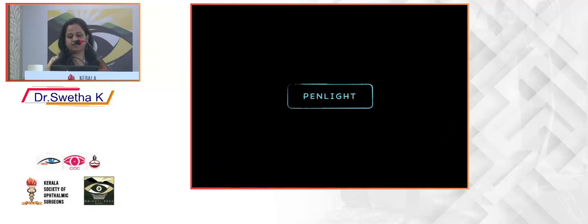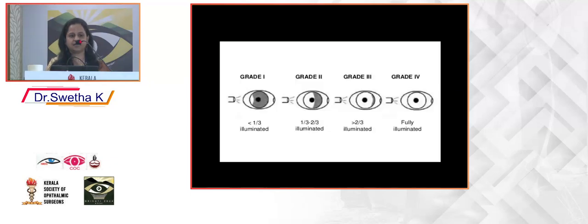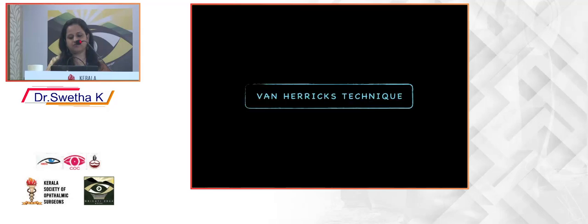So the diagnosis starts at the level of the optometrist. You can train your optometrists in the torchlight examination so that we do not miss any cases. Any case of doubt, they can send directly to you. You can grade it according to the torchlight examination as grade 1, 2, 3, and 4 as shown.